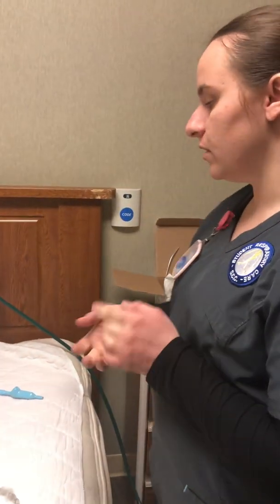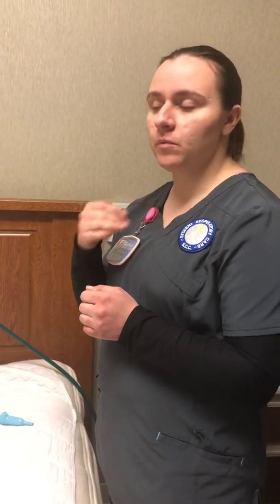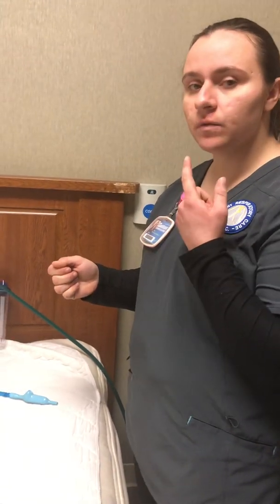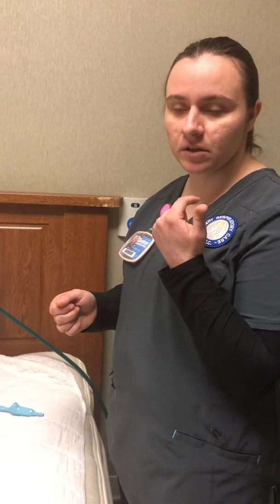And then before I do a cuff care, anything like that with a patient, I always want to do an oral care with them. But before I begin any of that, I always want to make sure I have appropriate PPE on, and I'm going to check the patient. So I'm going to listen to the patient's lung sounds, and I'm going to listen to their cuff, where that's at, see if I hear anything, any gurgling, if there's a leak, if it got loosened, anything like that. Then I'm also going to note what size of endotracheal tube the patient has, and also the placement of where it is placed in the patient.